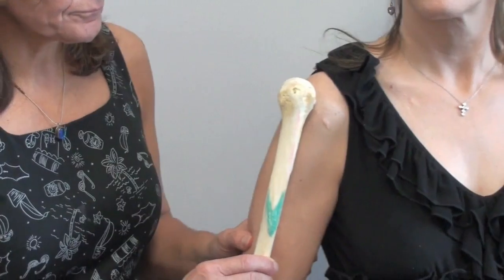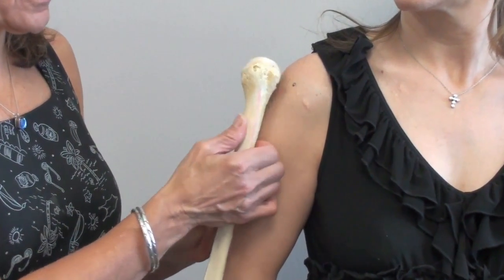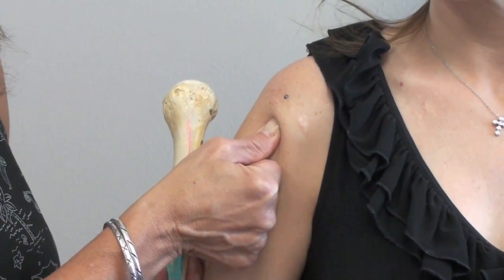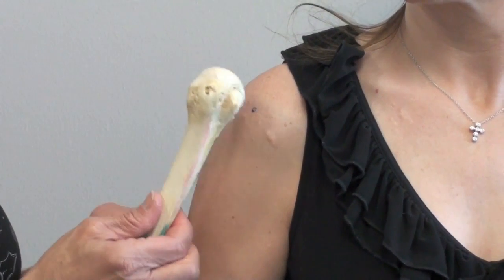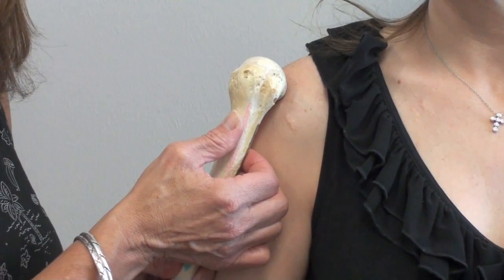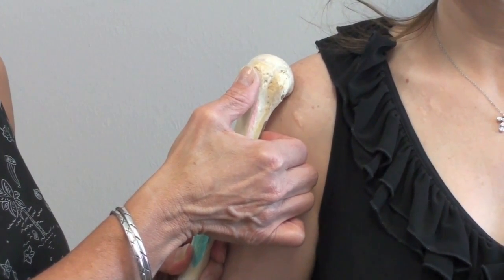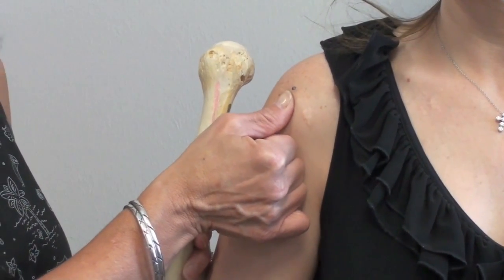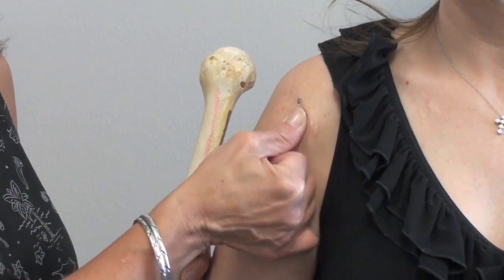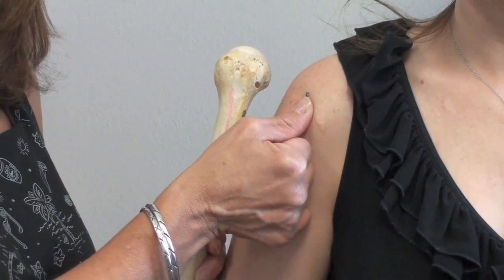Coming back this way, if you take your thumb and come up the humerus, I can seat it a little bit in the surgical neck. To locate the point at which you're going to put the needle in, you come up to the most prominent aspect of the proximal humerus. If you're having trouble feeling that, rotate your finger around a little bit — it helps you find where that most prominent aspect is.